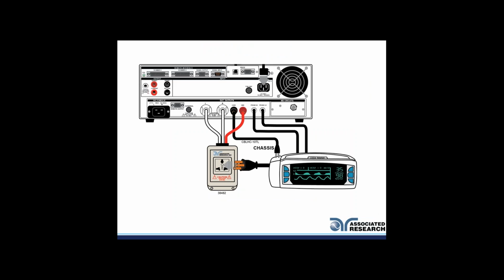Let's take a quick look at how the connections are made to a tester. Normally, you want to do your touch current test with the unit being powered on. So you want to be able to provide some kind of power to your device. In our Omnia tester, the power is provided via the line neutral connection, and the ground is connected to the ground on the back of the instrument. We use probe high and probe low to run the multiple different types of tests that we could run for the leakage, and I'll show you later on how those probe high and probe low are used in the standards.